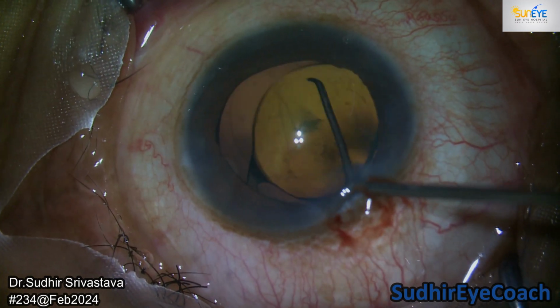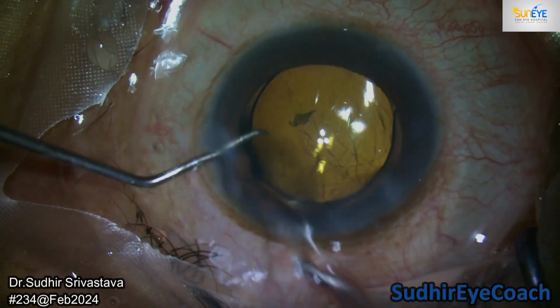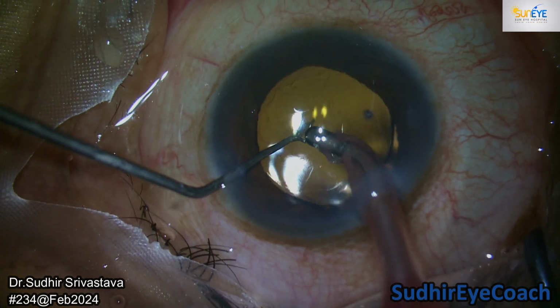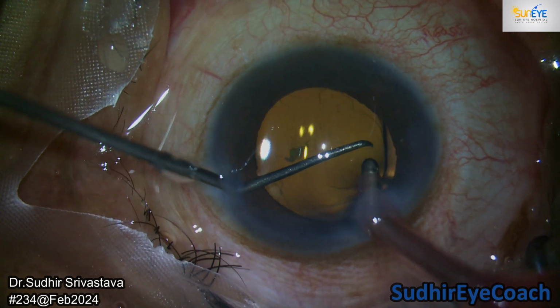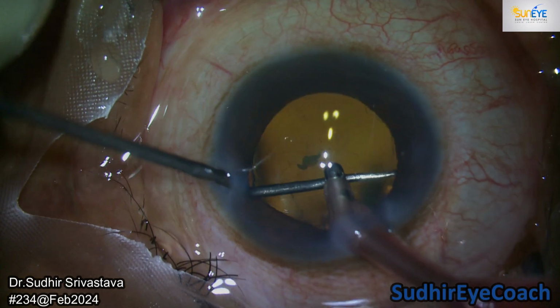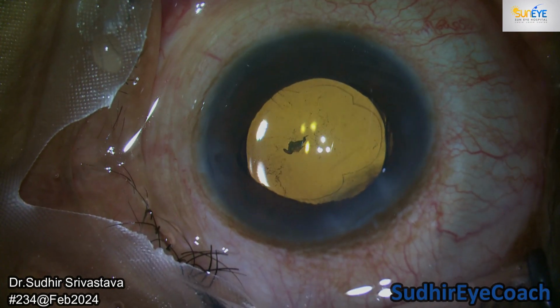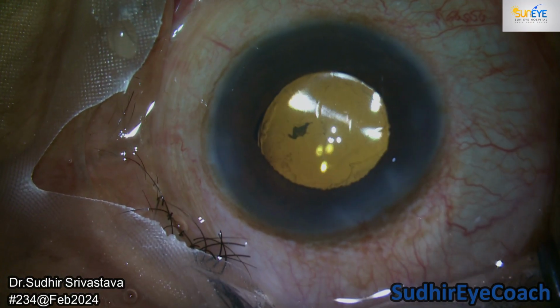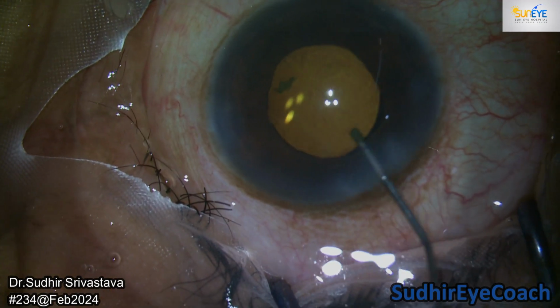So I dialed the single-piece implant, and this is the Impress implant from Hoya, which gives decent distance and intermediate vision, because I found that centration won't be an issue. So I continued with the same implant which we selected in the pre-op period. An excellent implant, and it leaves some amount of asphericity to give defocus for the intermediate vision.